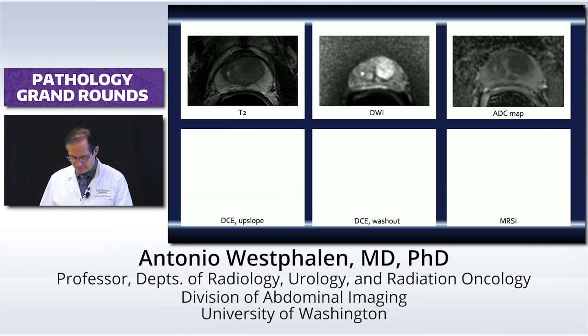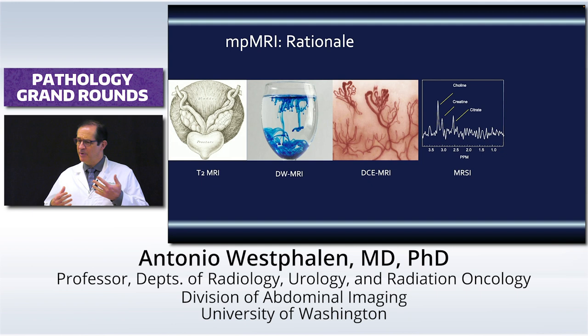Now, there are reasons to use each one of these sequences. And I remember talking to a urologist once, and he kept asking, we were writing a grant, and he kept asking, how do we describe this, and why is this? And then the easiest way to describe it to him was, okay, think of MR not as a single test, but think of MR as multiple different exams, multiple different lab tests acquired on the same machine.